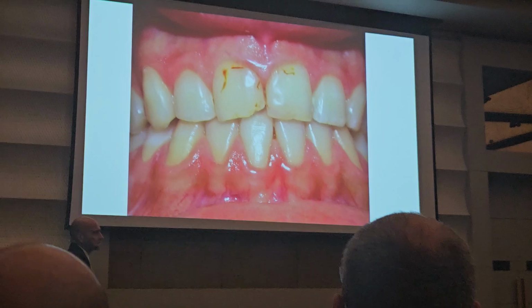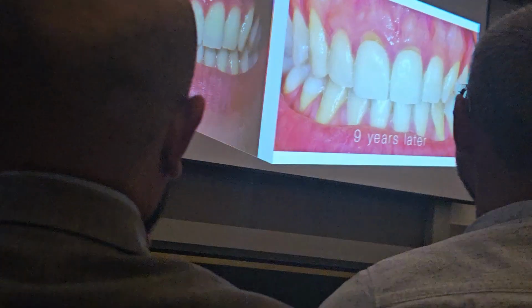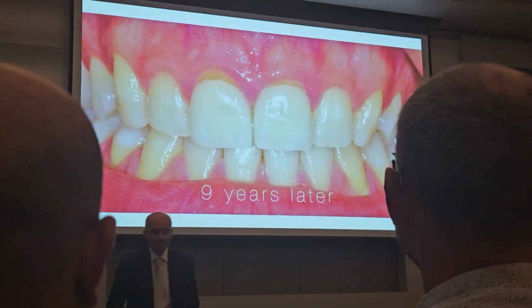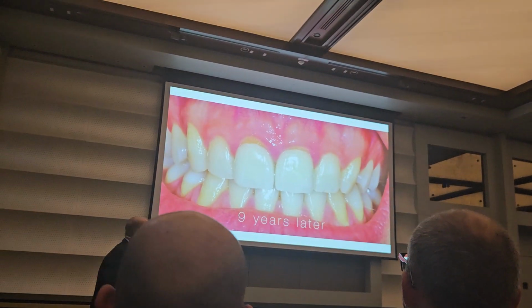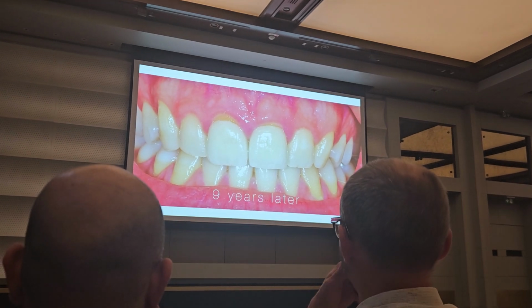Sometimes you do everything good. You do your perfect shoulder. This is a very old case. You do your beautiful feldspar crowns. But still, when you follow up the patients at 10, 15 years, you see that all the cases go in different directions from what we think on the first day. Completely different.